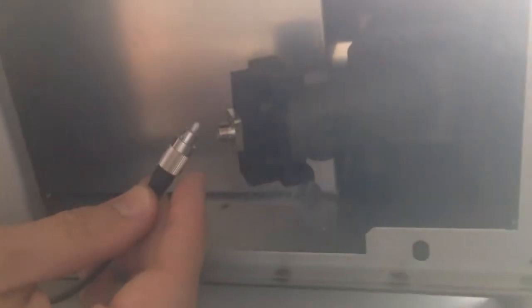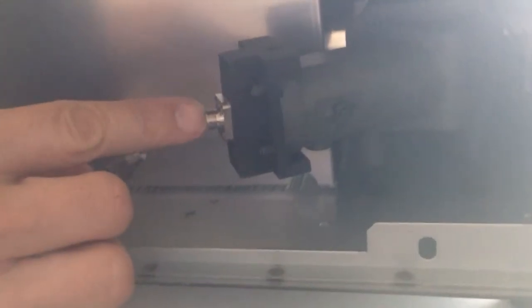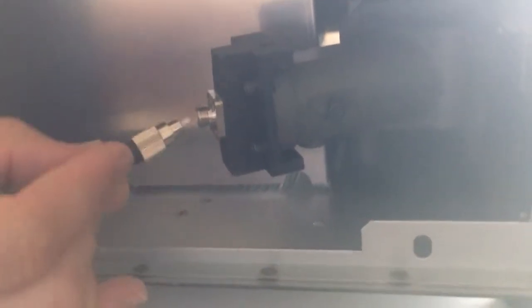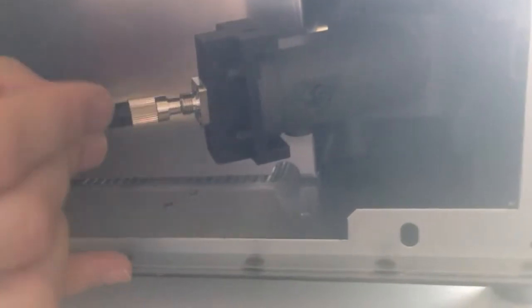Now this is keyed. It's kind of hard to see, but there is a little key right there and you want to make sure it lines up with a notch on the back side. So you're going to push it in, get it keyed in, and then screw it tight.